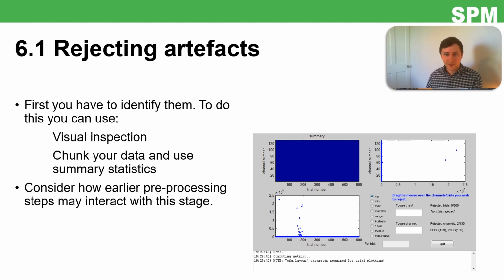That's what I like to do, I think. Usually when you've spent so long designing an experiment, so long collecting that data, you're going to be spending a long time analysing it. Spending a week or something like that, depending on how much data you have, just scrolling through and labeling bad segments is well worth doing.